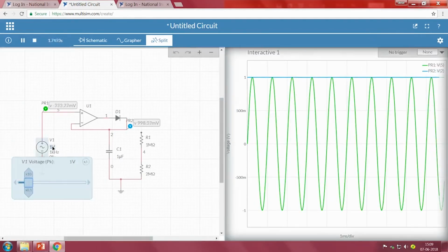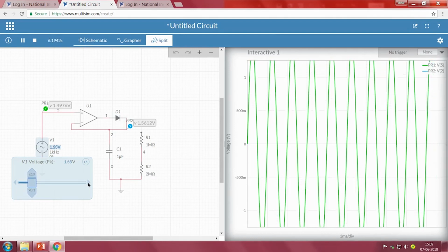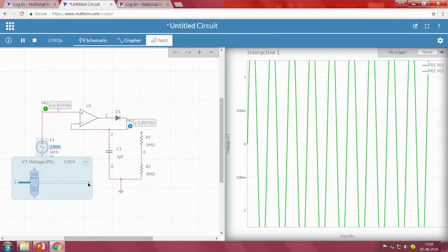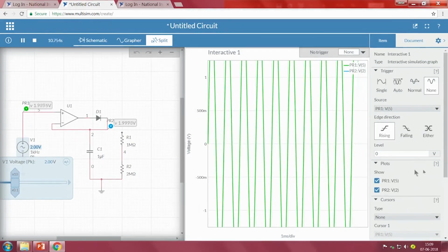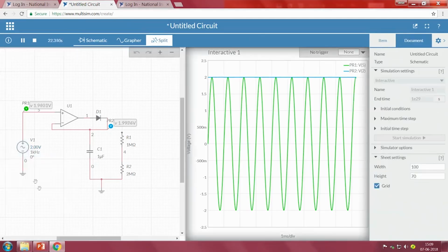Now, this voltage I will change it to 1.05, slowly to 2 volts. Now, it is at 2 volts. Now, let me change the settings of the graph to voltage. If you observe now, the capacitor started increasing to the value of the input peak value, is it not?